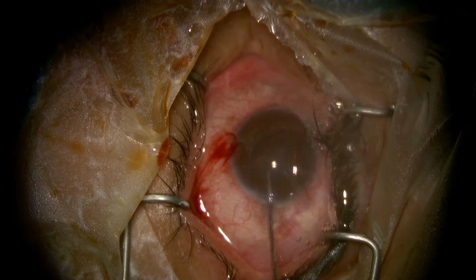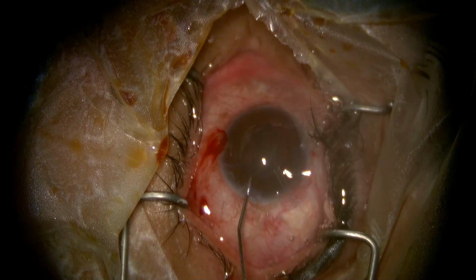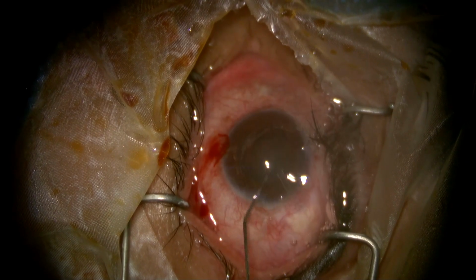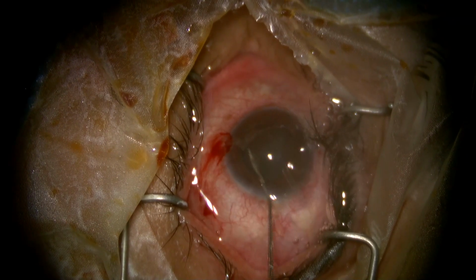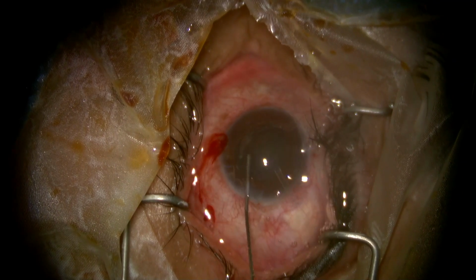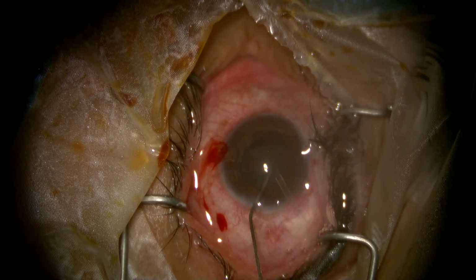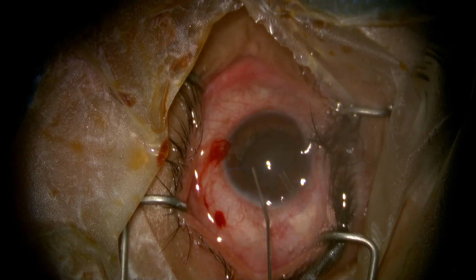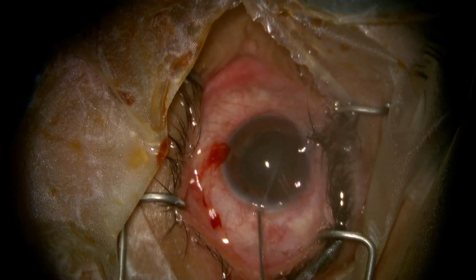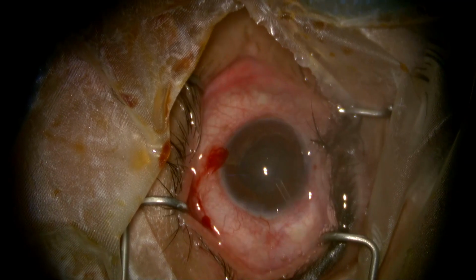Now it's an early posterior subcapsular cataract. After performing hydrodissection and hydrodelineation, we will be doing routine phacoemulsification surgery under low fluid parameters.